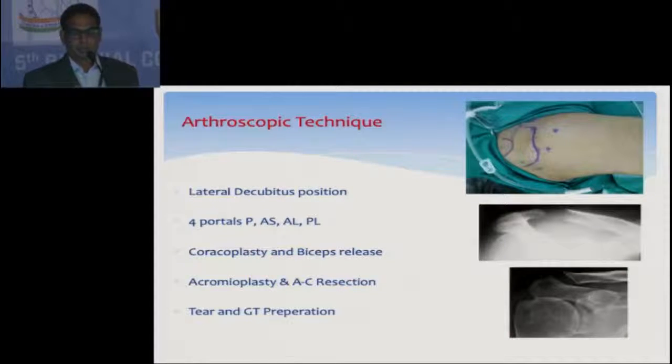First I do subcoracoid coracoplasty, then release the biceps all around, do the biceps tenotomy, then acromioplasty, AC resection, and later on I use the biceps in the cuff repair.